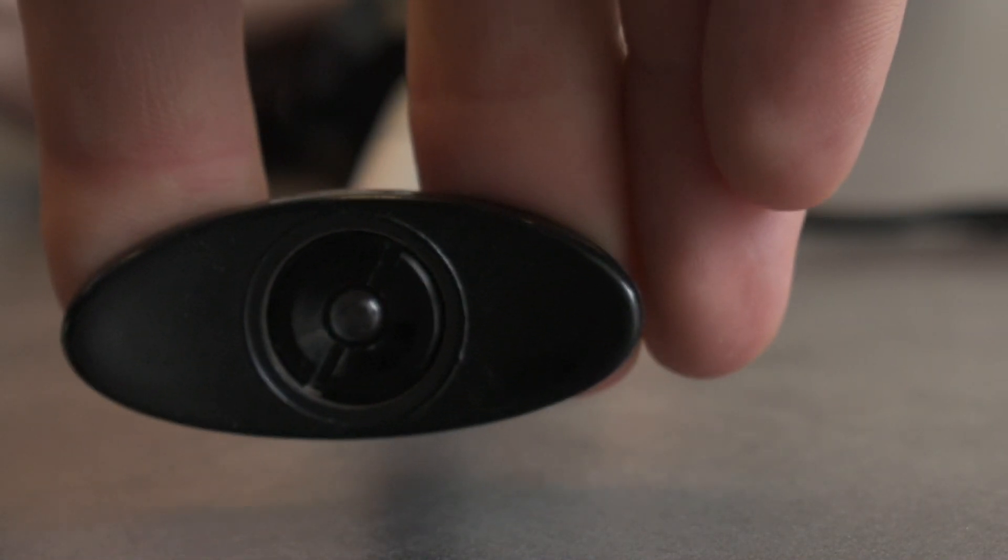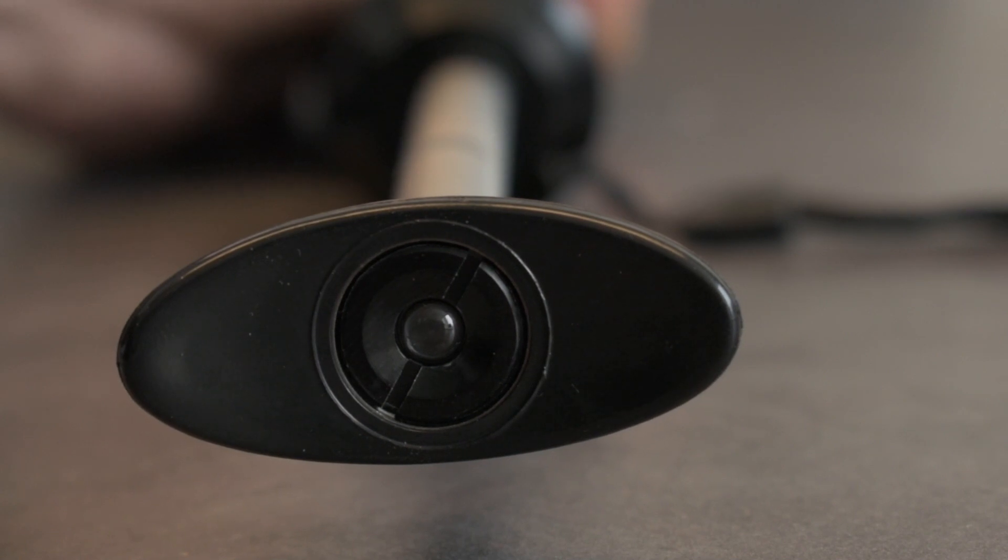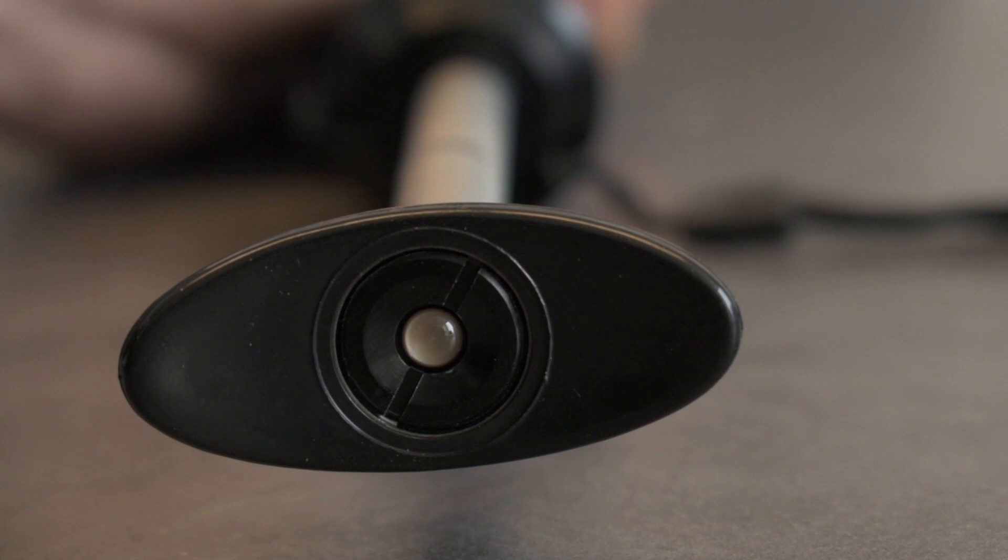With the handle fully extended, your sample time begins. To determine if your sample is complete, look at the bottom of the pump handle. If it's clear, the sample is still in progress. If it's white, then the sample is complete.